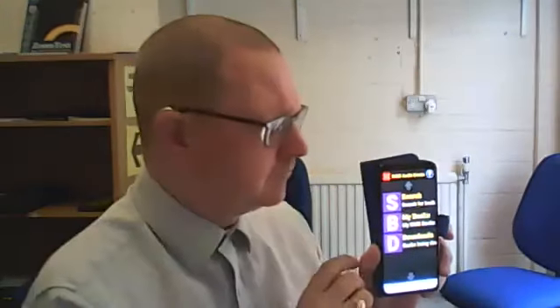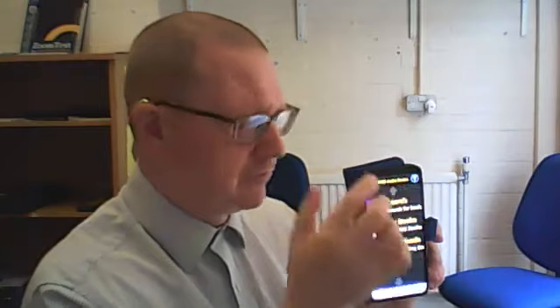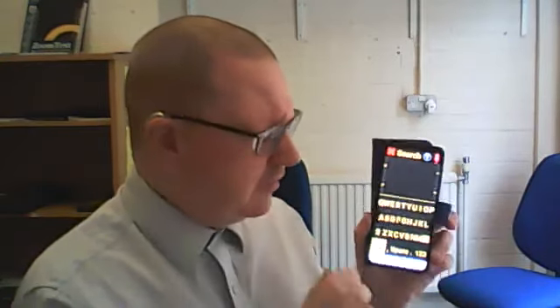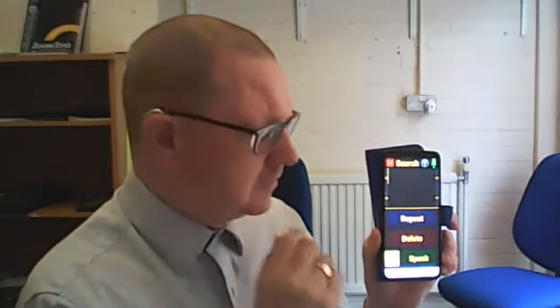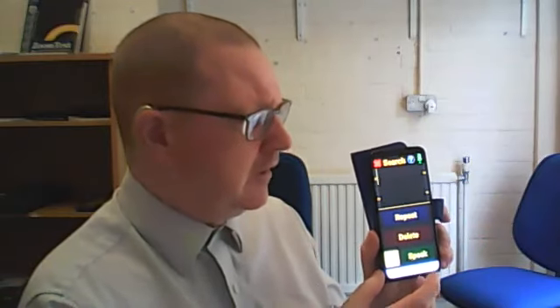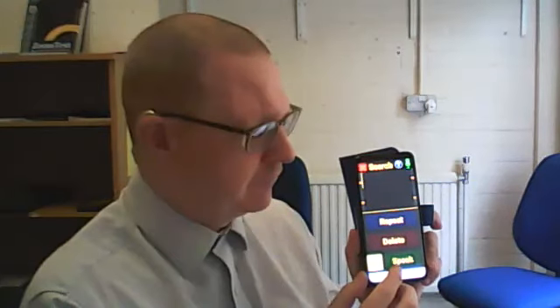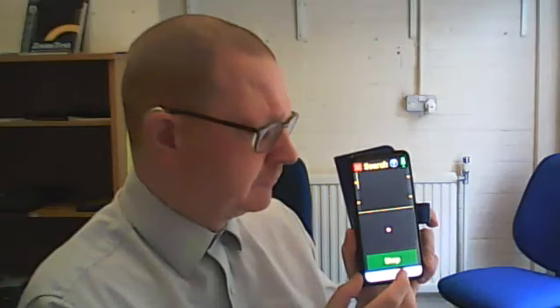RNIB audio books. Page 1 of 1. And I'm going to search for a book. My books. Downloads. Search. Please type in search words. So I'm going to dictate it. Speech recognition mode on. Press speak button at bottom of screen, then start speaking. And I'm going to search for a book called Along Came a Spider. Speak.